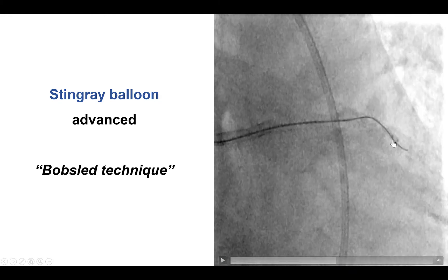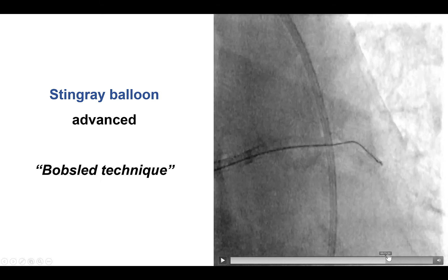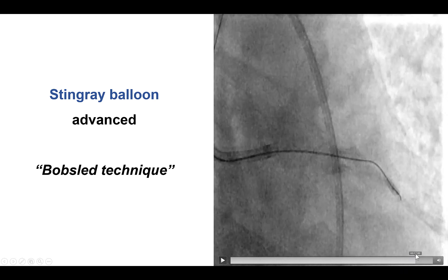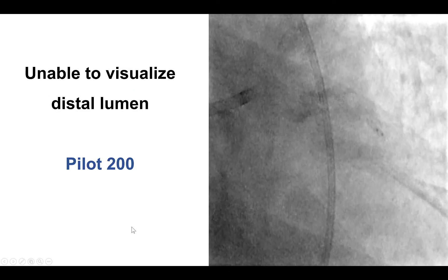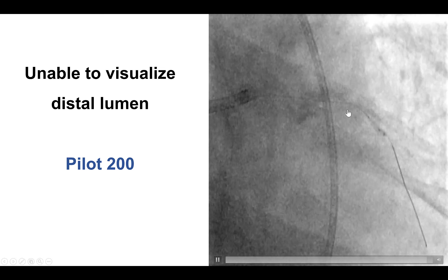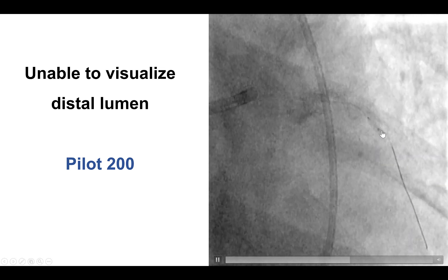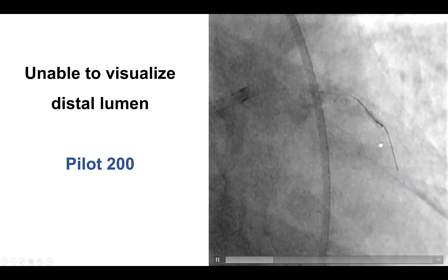We then repeated the double blind stick and swap technique. The stiff wire was initially exiting proximal to the proximal marker of the Stingray balloon, so the wire was pulled back and redirected until it exited between the two markers of the Stingray balloon, as shown here. The stiff wire was then replaced with a Pilot 200 polymer-jacketed wire, which very easily advanced between the two markers through the exit port, and then followed nicely the course of the LAD, suggesting true lumen re-entry.